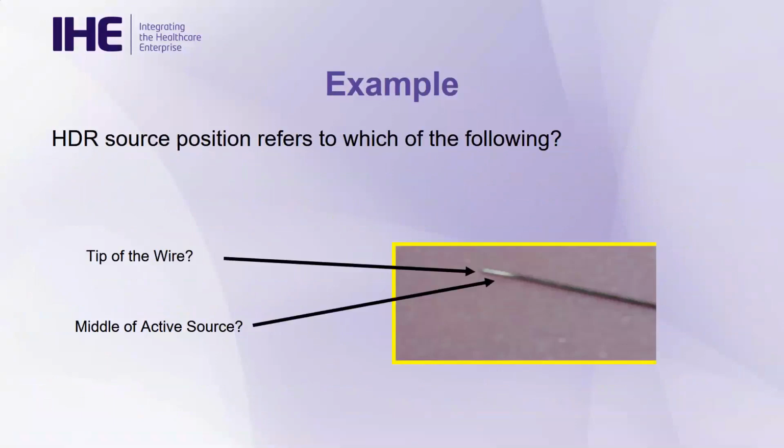And the needs, and this slide's from Scott Hadley: why do we need IHE-RO? Well, an example is HDR source position. It may seem a minor point if you aren't involved in brachytherapy clinically, but what do we mean by source position? Do we mean the middle of the active source? Do we mean the tip of the wire, or what's the location? It may not seem like much, but in brachytherapy, a few millimeters can be very important when we're determining dose. So this could be a significant source of error if we don't agree on where the source position is.